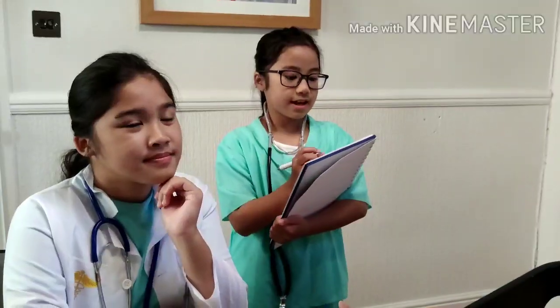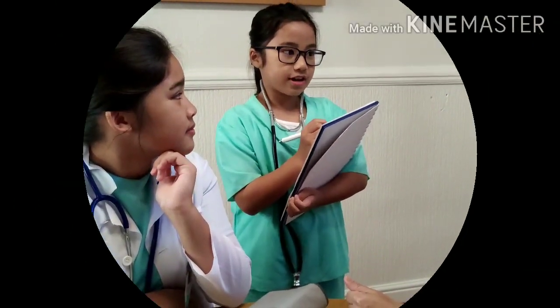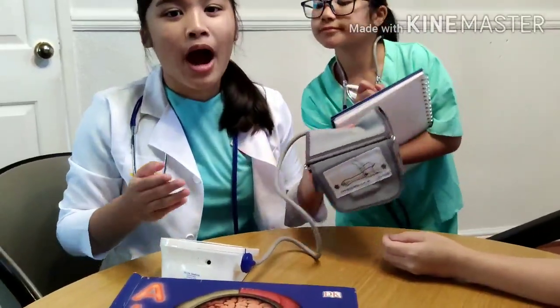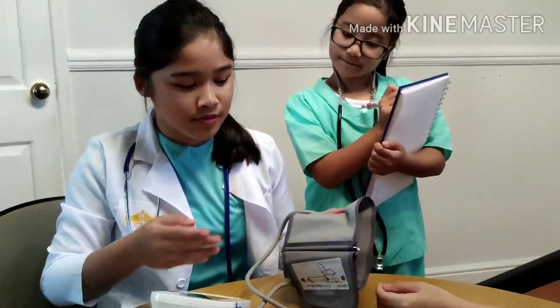Be relaxed, but don't be anxious or stressed. There's a cuff, and this tube here you see is connected to the monitor where I'll be reading the patient's blood pressure reading.